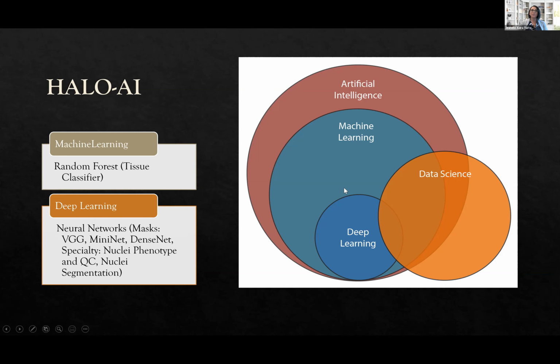It takes the input images and assigns importance, so it's really important for the deep learning approach to use hierarchical training, and the important thing is that the images are easy to process without losing the features which are critical for getting a good image classification prediction. So in HALO, there are two aspects.